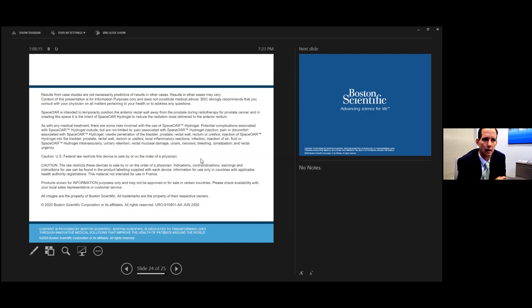So the process there is that we do imaging. Traditionally, that would be a CT and a bone scan, but we nowadays use what are called PET scans, which use a substance that localizes to where prostate cancer cells are, hopefully, and then emits radiation that's picked up by a detector and then co-localizes it on a CT scan done at the same time.